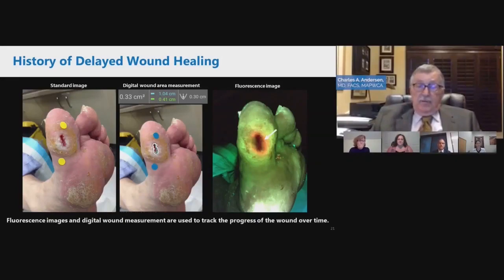One of the features of the device that we use, I know everybody that has the device doesn't, but we find it very, very useful, is once we scan a patient, we start a patient file. And so it's a number, so number 564 or whatever, and then every time we scan that patient, the image and the scan go back in that file.